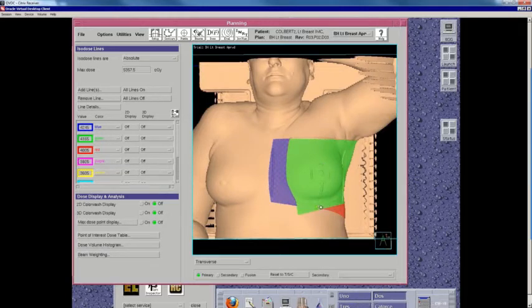We also marked an inferior border. The textbooks would tell you to put about a 2-centimeter margin from the inframammary sulcus to your inferior border. I typically make my border a little tighter than that, about 8 millimeters. With our setup, it's very stable and reproducible, and you just don't need to treat the abdominal wall, so you can avoid that toxicity. I mark midline as a starting place, and then I place my lateral wire, which is honestly almost irrelevant, but I do it for historical sake, around the mid-axillary line, or at the posterior edge of the breast tissue.